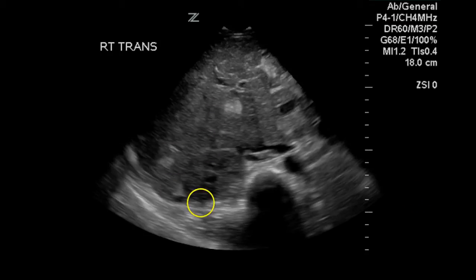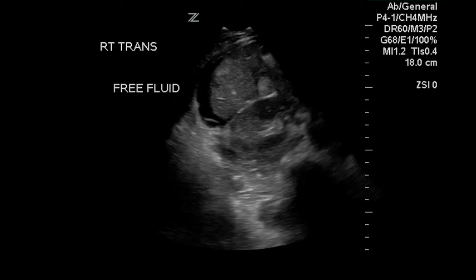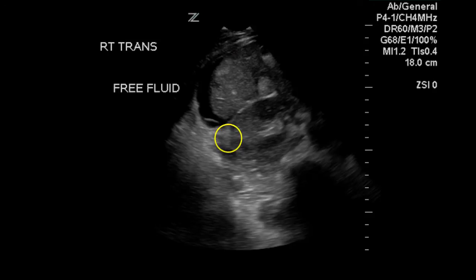Here are some more tumors. The cross-section of the kidney can be seen on this image as well. This image also demonstrates some ascites at the top of the liver.